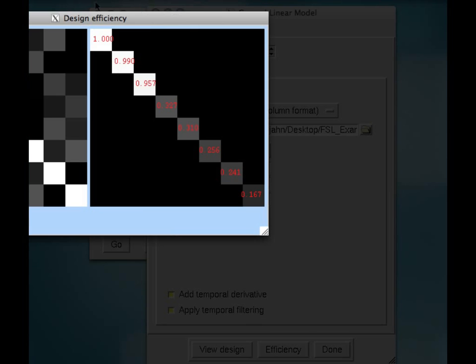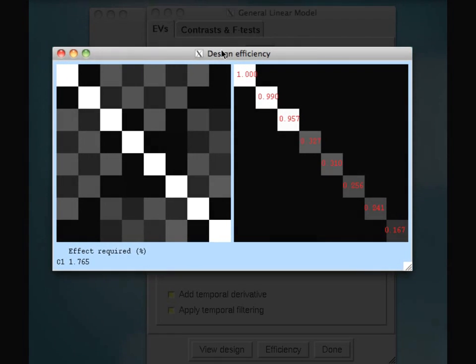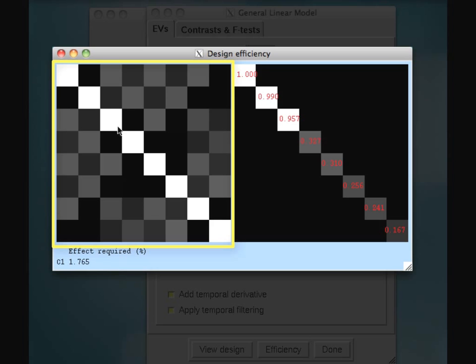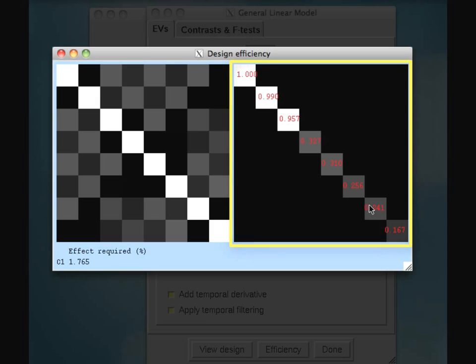Lastly, you can click on this efficiency tab over here, and this first square over here. This represents any correlation between your different regressors. Notice that these diagonals, they should all be white because these represent each of the conditions correlated with itself, which will be one. So notice that this first one, the first regressor I put in was tap left, and then its temporal derivative, tap right, temporal derivative, and so on. Now, if any of these off-diagonal boxes are very bright or white, we would have a problem because two of our regressors would be very highly correlated. Now, this isn't too bad, so it looks okay.